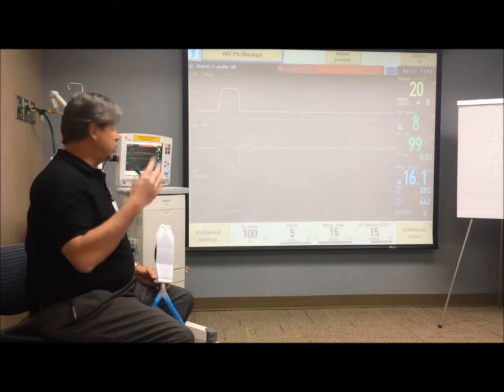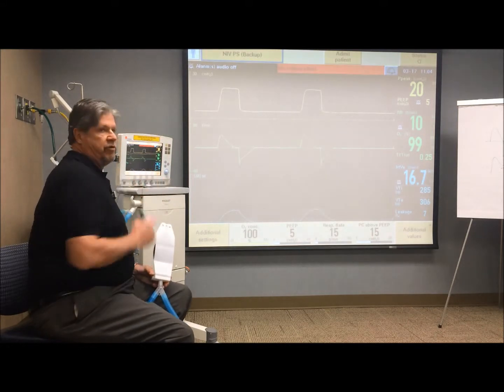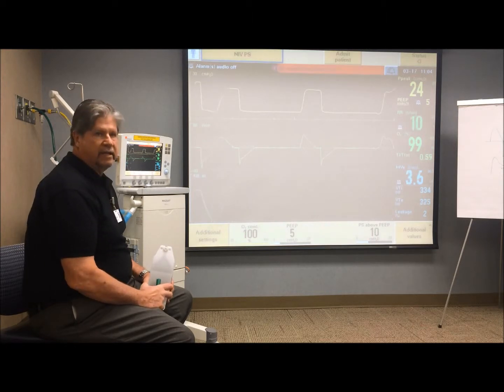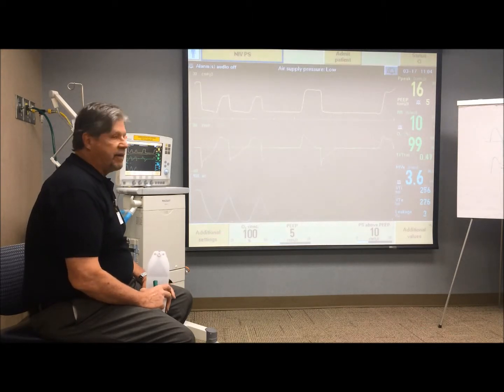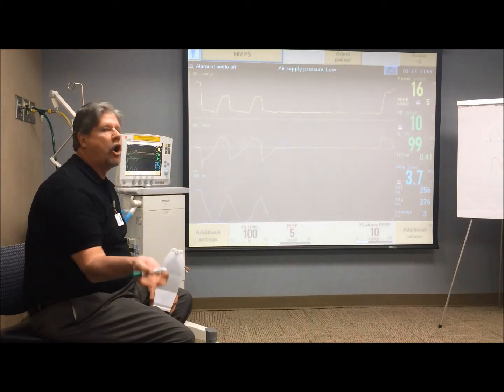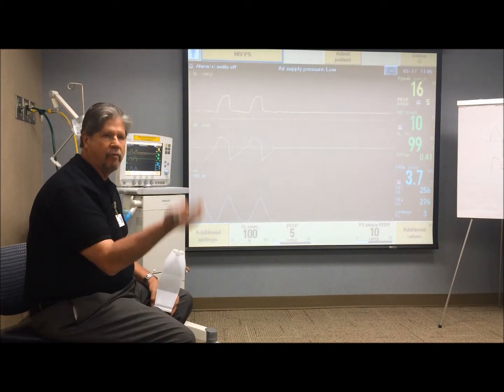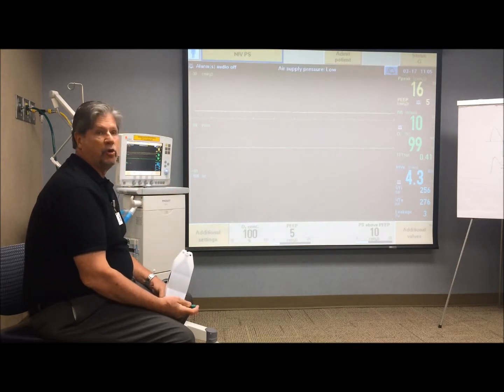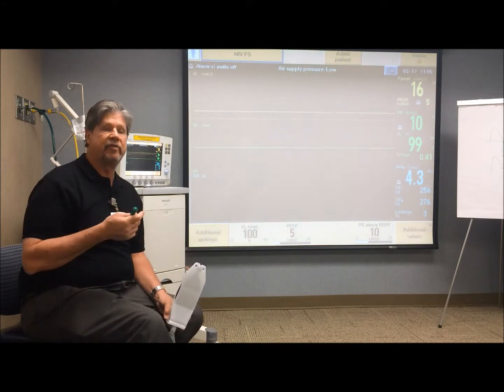And now the ventilator goes into, and see there's the rate, your respiratory rate. And now if he wakes up and starts breathing again, he resets it, okay? Then if he stops, it'll go back, and he can do this all the time. He can keep doing this, go back and forth, apnea versus not apnea, and there'll be no limit to the amount of time that he can do this.